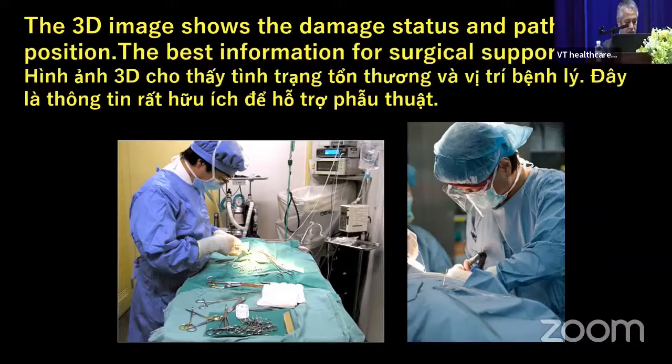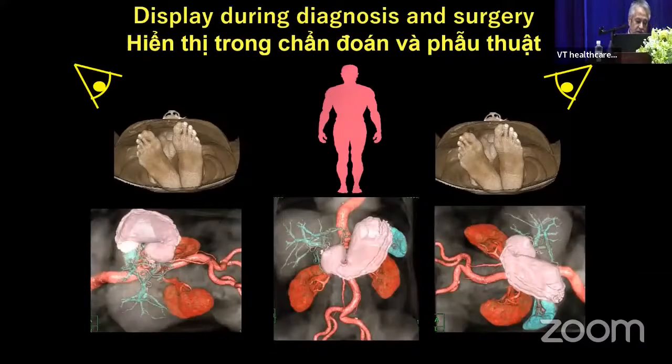It's also possible to display from the line of sight of the operator's standing position. This shows the display at the time of diagnosis and surgery. The images when standing on the left and right side of the patient are different. The central 3D image is the true front view of the patient, facing the patient at the time of diagnosis.